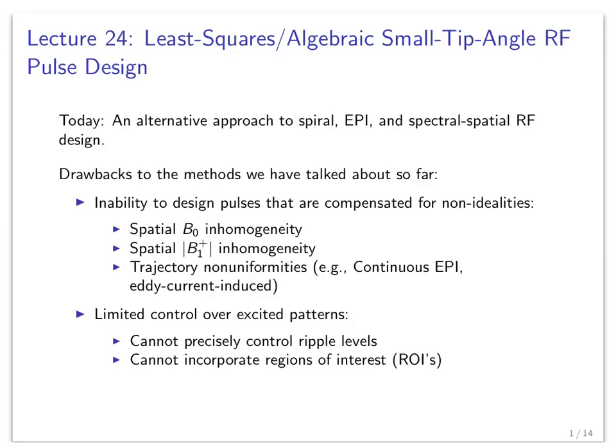So welcome to lecture 24. This lecture is going to be talking about least squares, or linear algebraic, small tip angle RF pulse design.